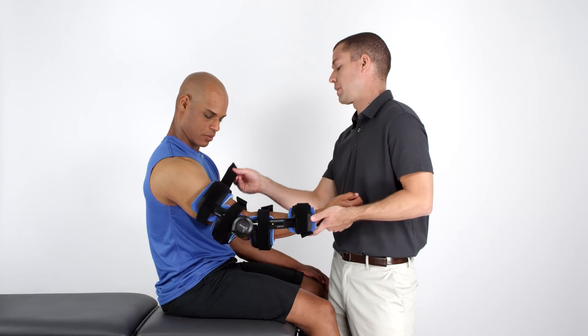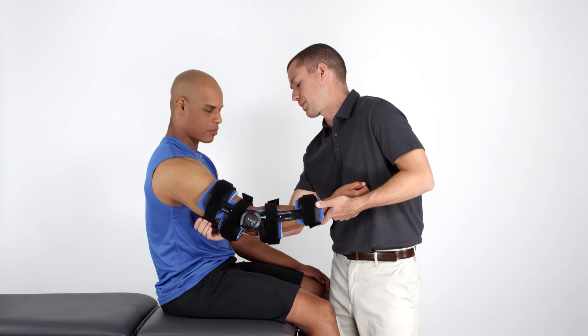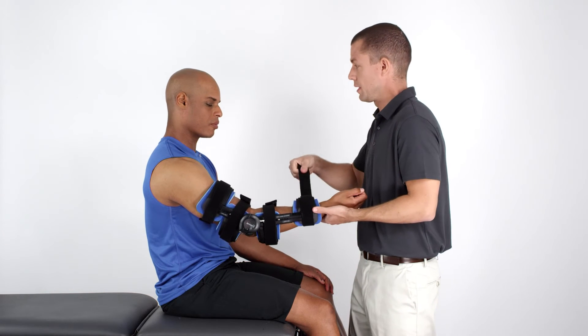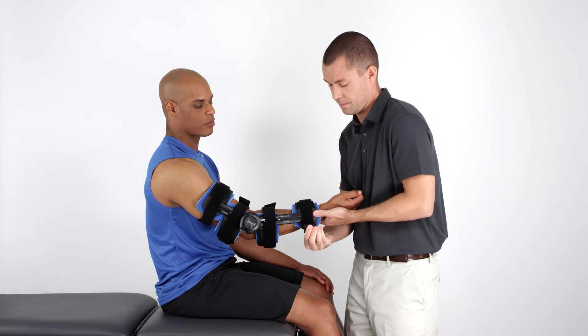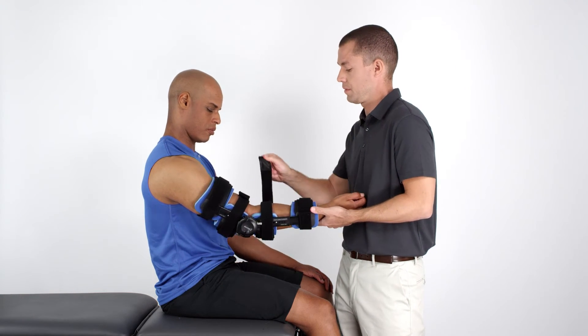Once you've adjusted and positioned the orthosis on the patient's arm, secure the straps. First, secure the proximal and distal straps. Then, secure the middle straps.